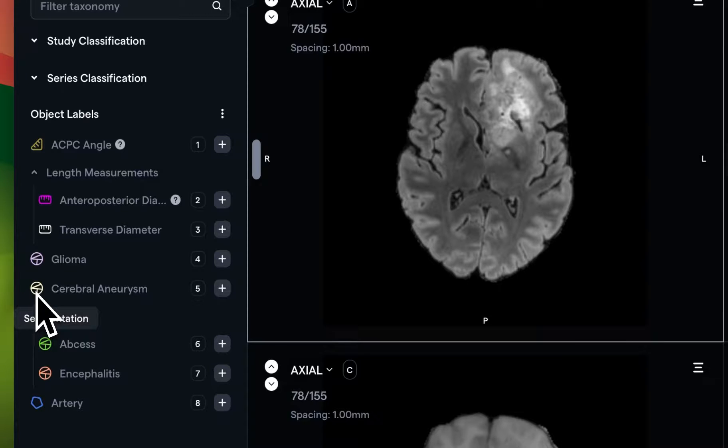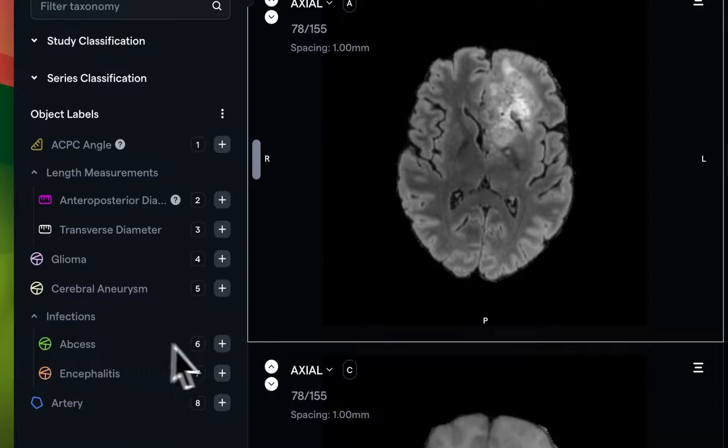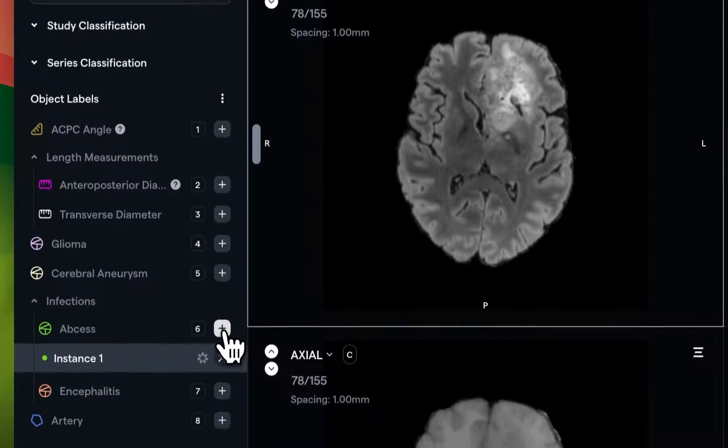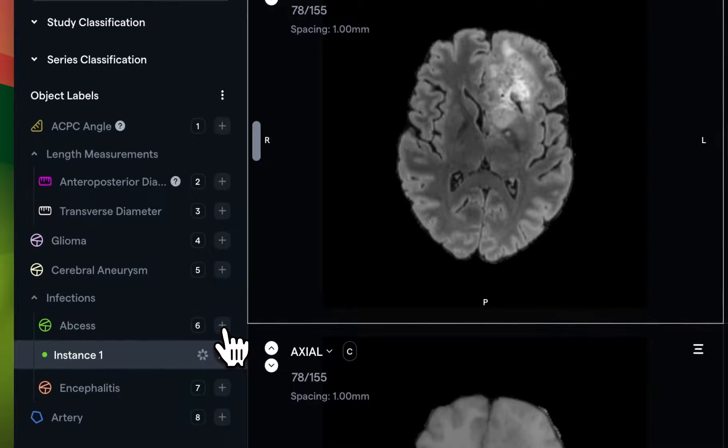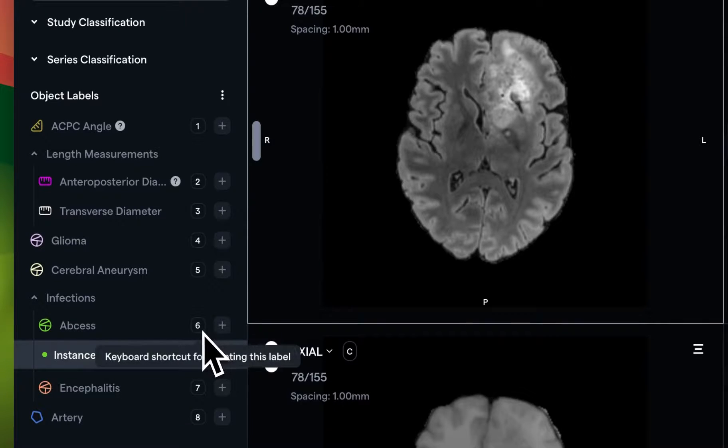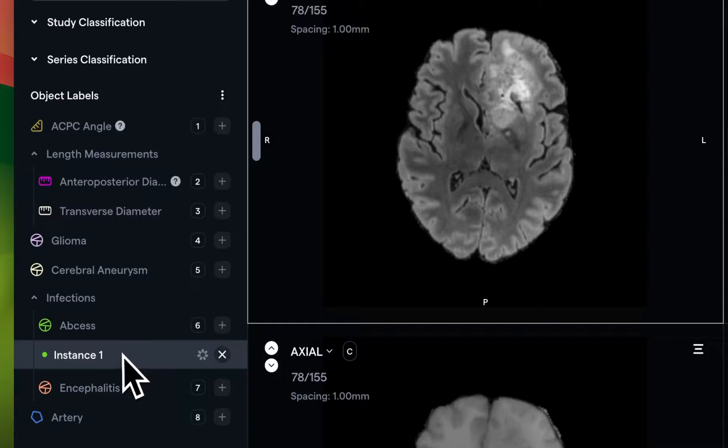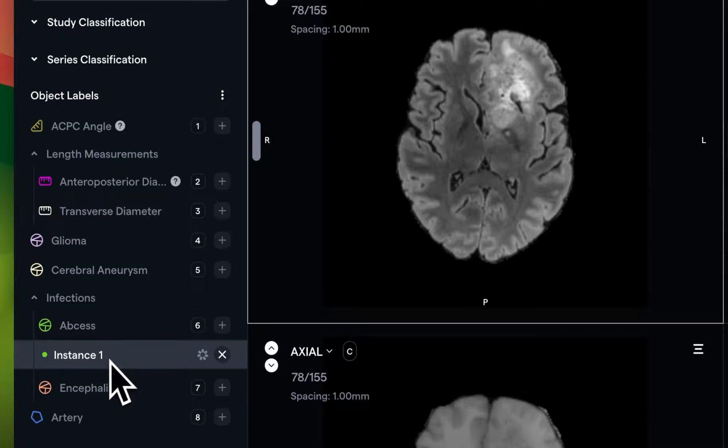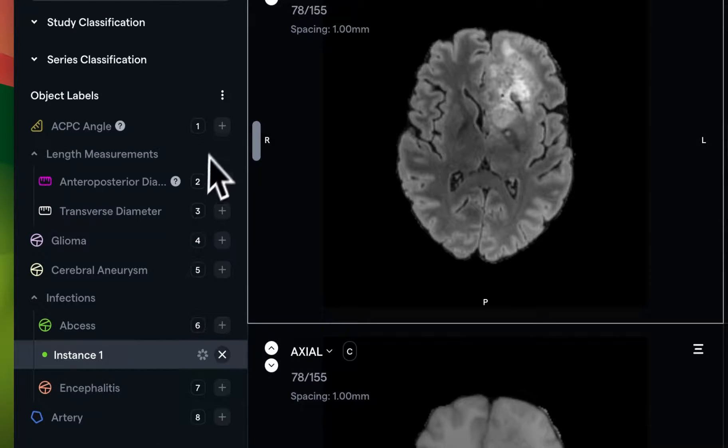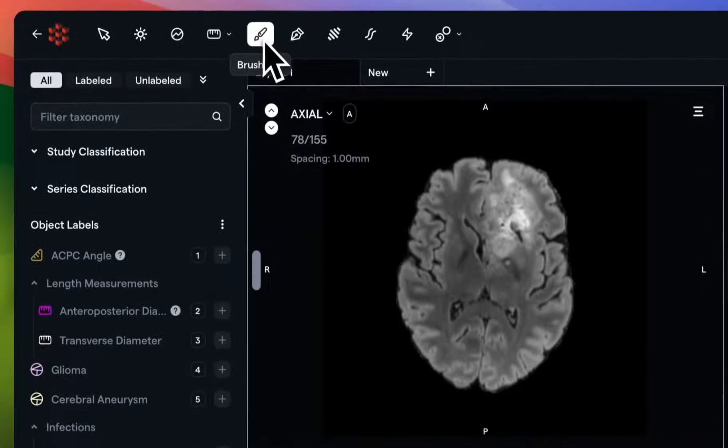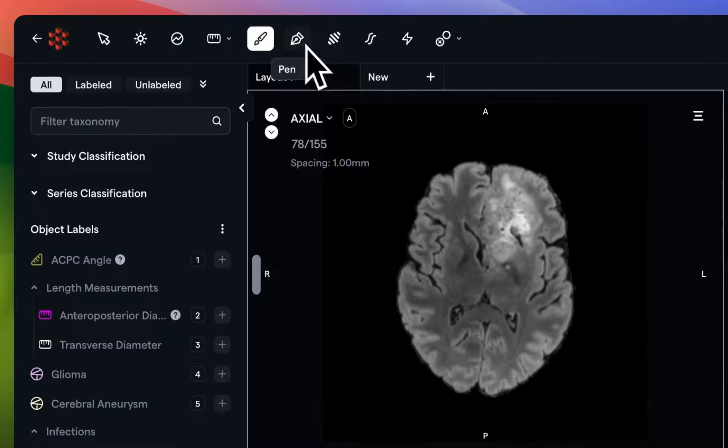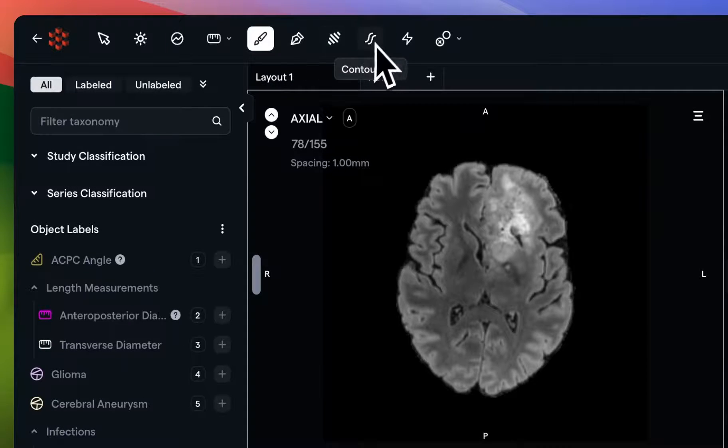In our case, let's create a simple segmentation, specifically an Abscess, by clicking on the plus button or using the numeric hotkey. You'll see that an instance of the segmentation has been generated, and several segmentation tools are now visible in the top bar.